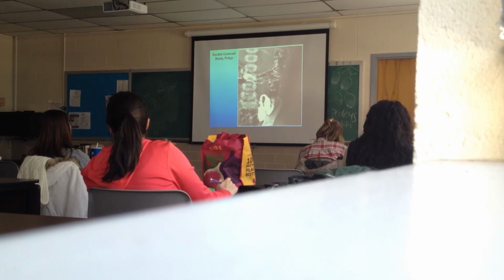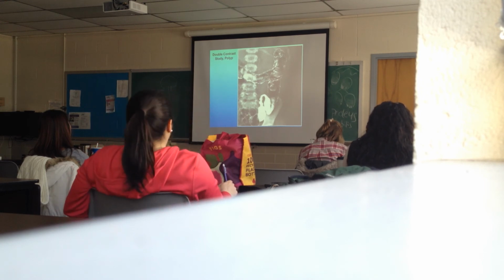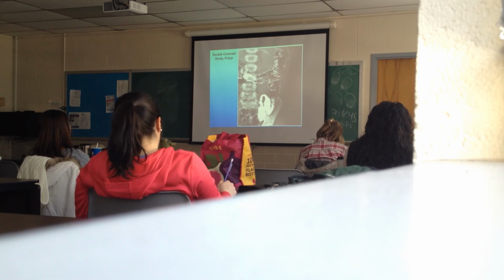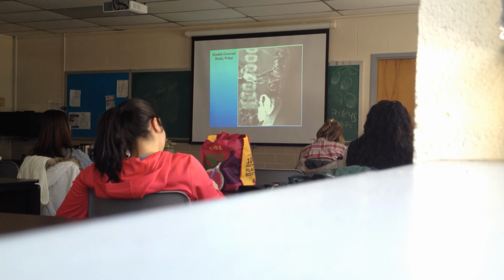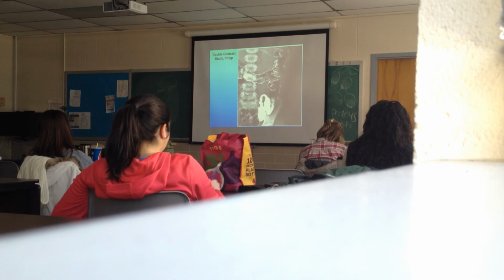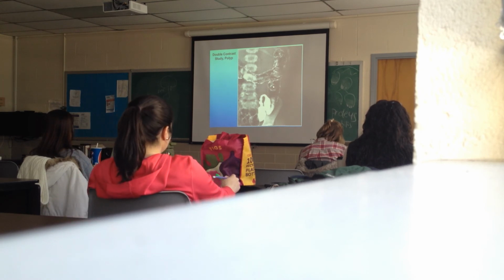There's a lot of redundancy in the sigmoid colon, but why is the strictured area strictured? Peristaltic wave? Normal peristaltic wave. What kind of polyp is that? Gross morphology. Pedunculated.